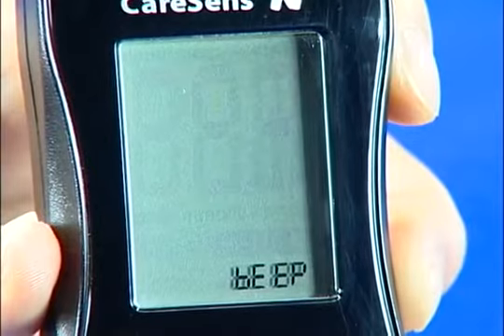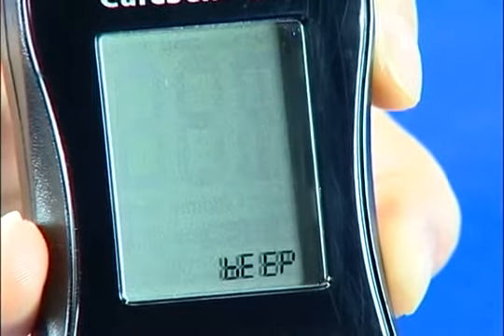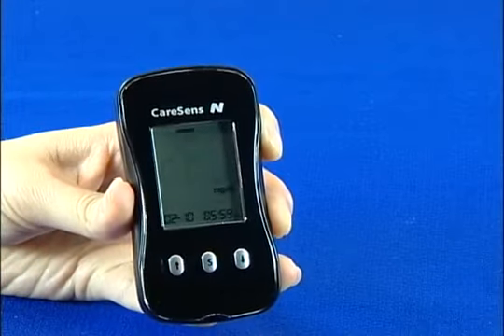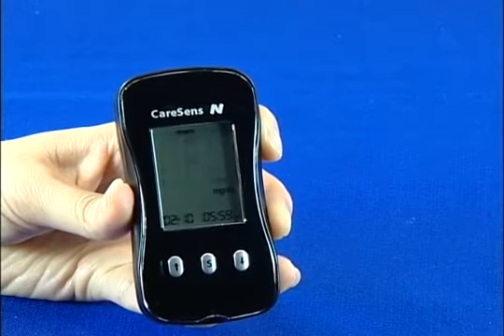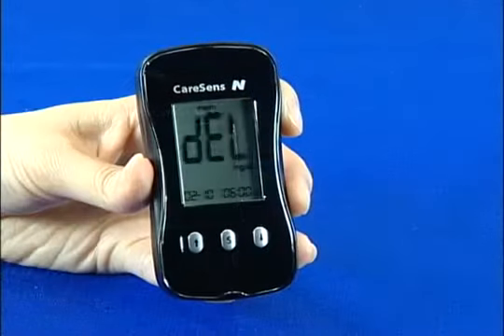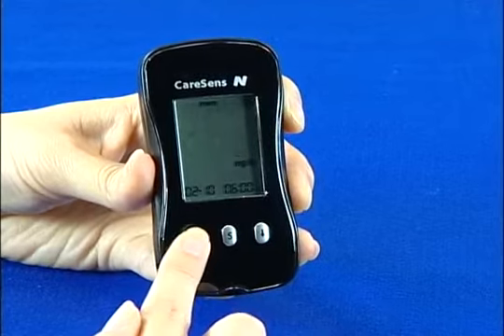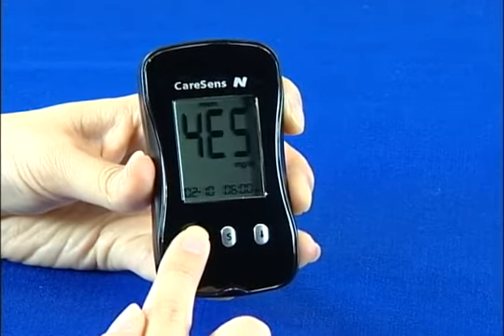If you want, you can also erase all stored test values. If you press the S button once again after the beep sound on or off setting, the word DELETE will blink. Use the left or right button to choose yes or no. Pushing the S button at yes will delete all values and display a zero.